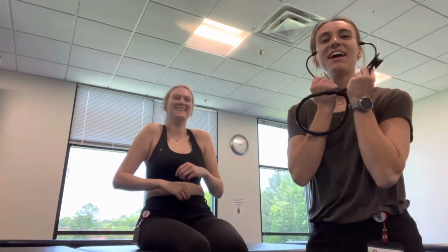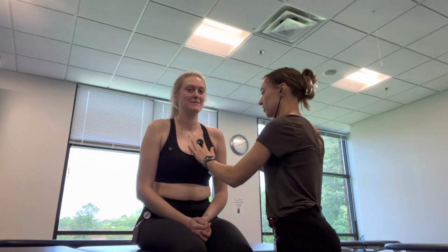I'll cut that out. Hi, my hands are super cold. Okay, so I'm going to do auscultation. We're going to do heart sounds first. Okay. So we're going to start with aortic. Just breathe normally.